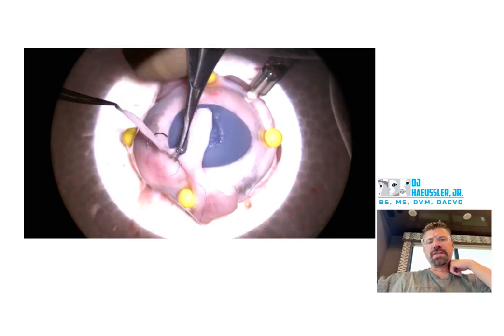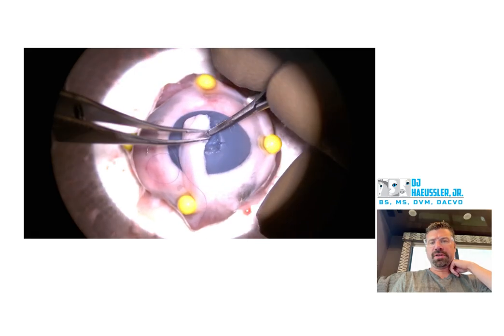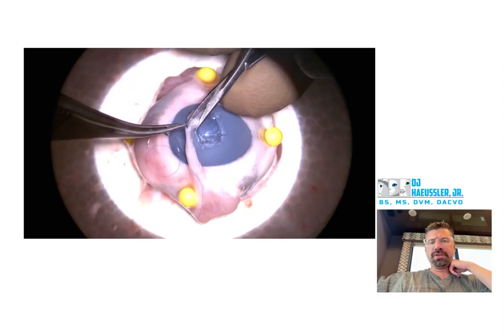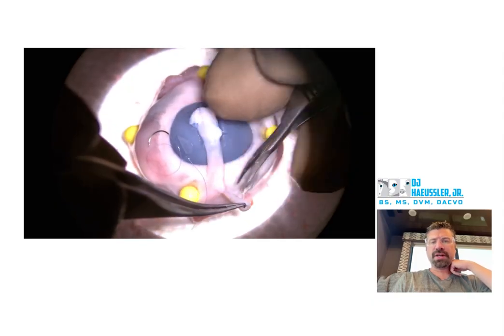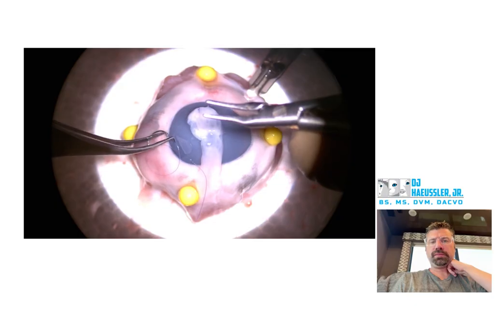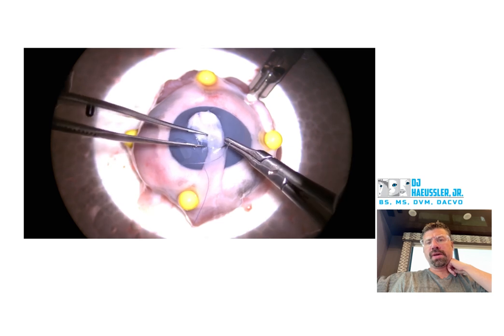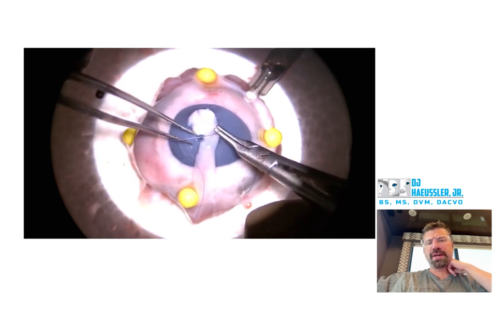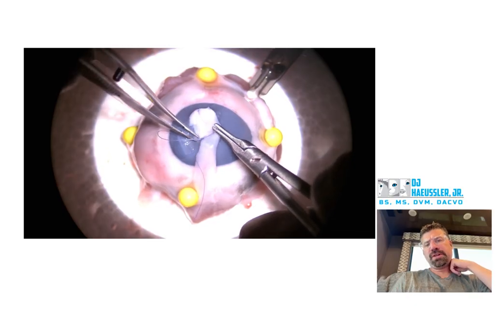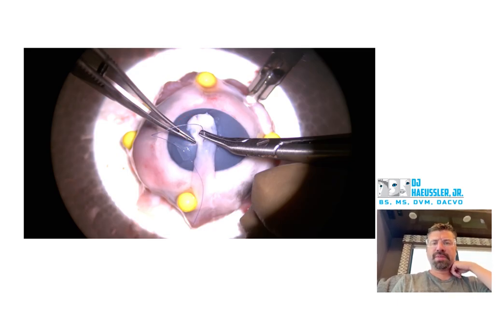Don't use Vannas scissors to cut conjunctiva — you're going to really dull those very, very quickly. You should absolutely be using Stevens tenotomy scissors right here. You probably could have removed more tenons from underneath the head of the pedicle, and you probably could have trimmed down your edge right here. That could probably be trimmed down a little bit further to tighten it up.